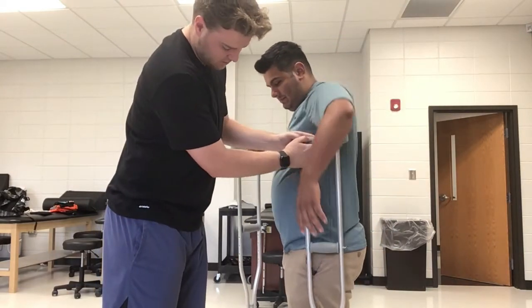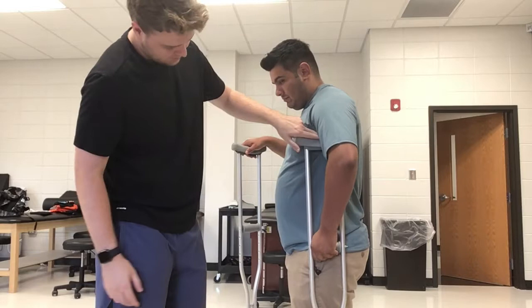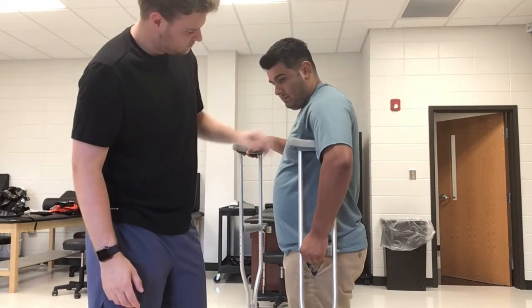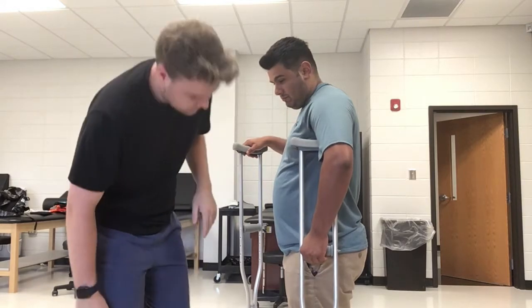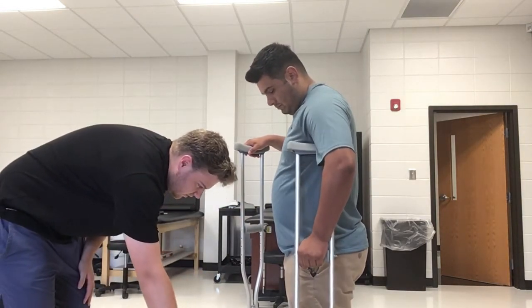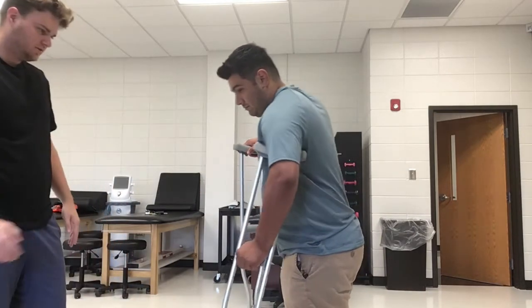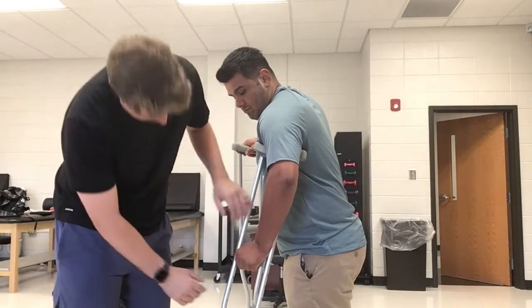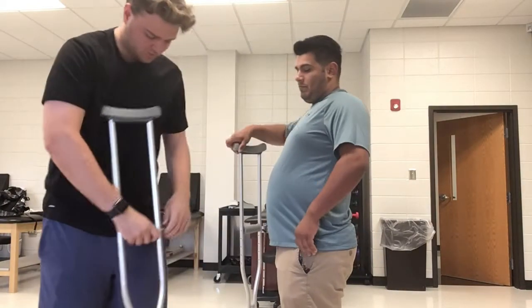I'm going to go ahead and just place this here. Let's see, I think we've got a good amount of space there. All right, so we're going to have you pull out 6 inches to the right here, and then 6 inches forward. And then I think we need a little bit less of an angle here, so I'm gonna move our grip down one more.